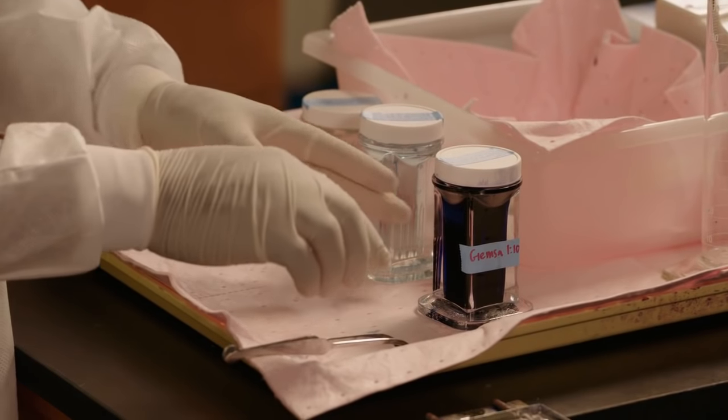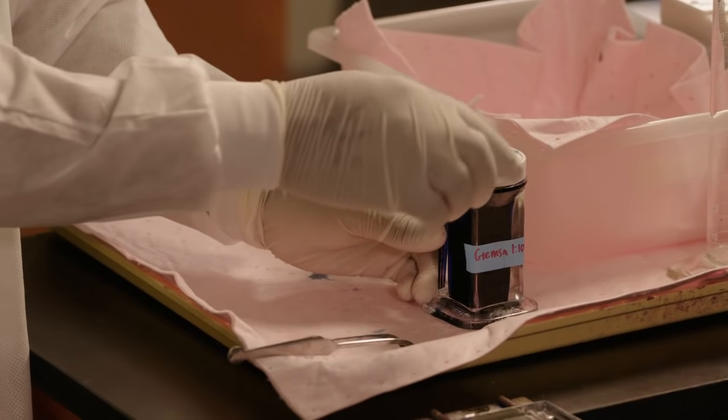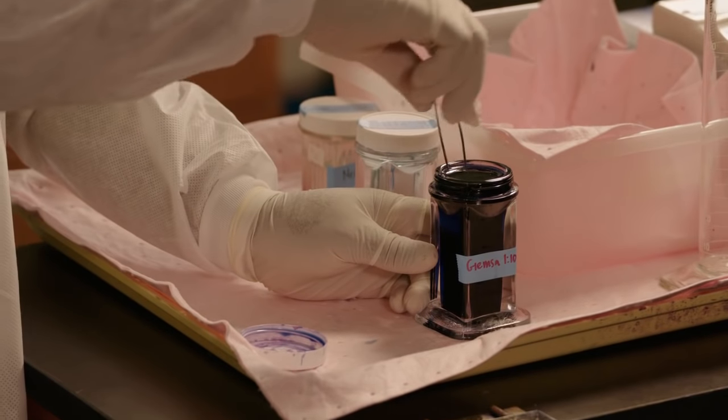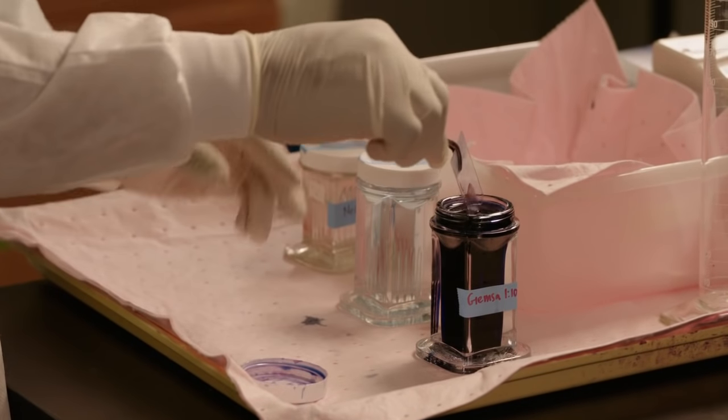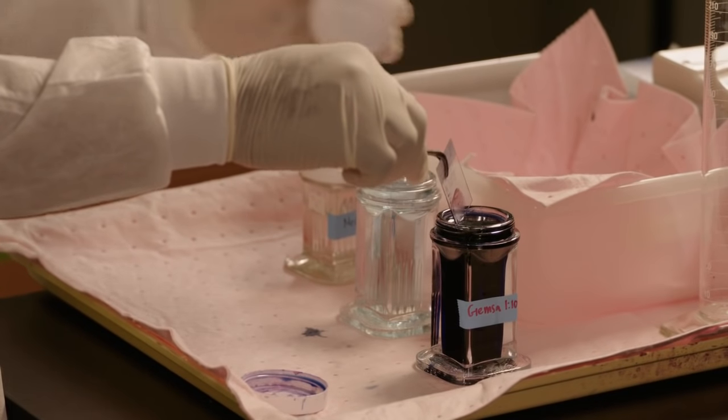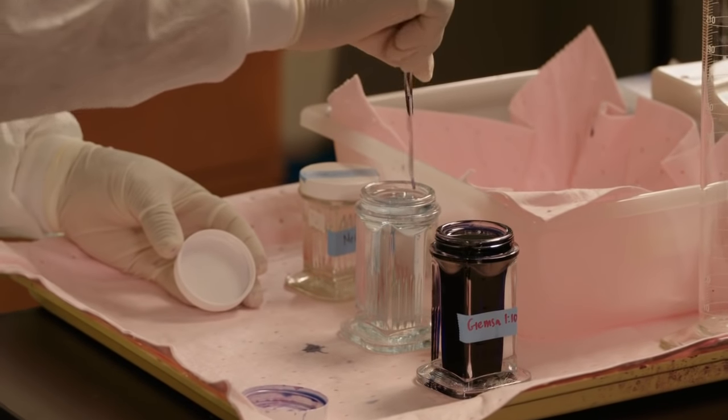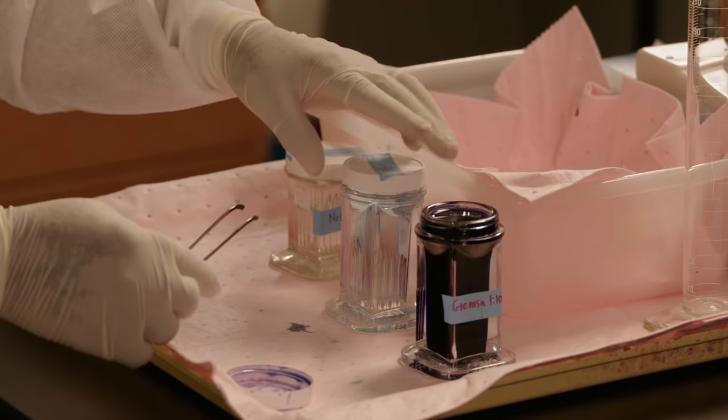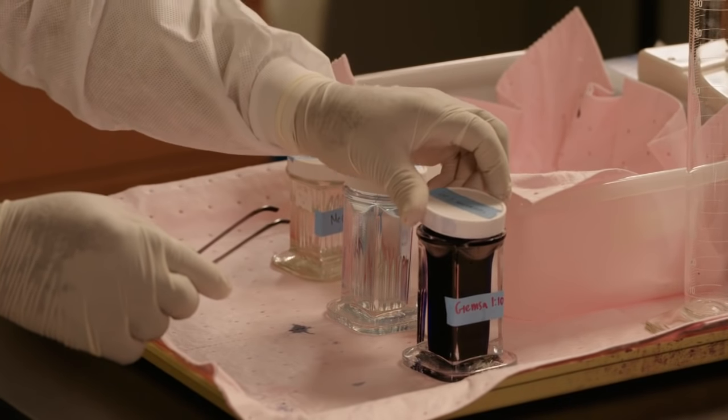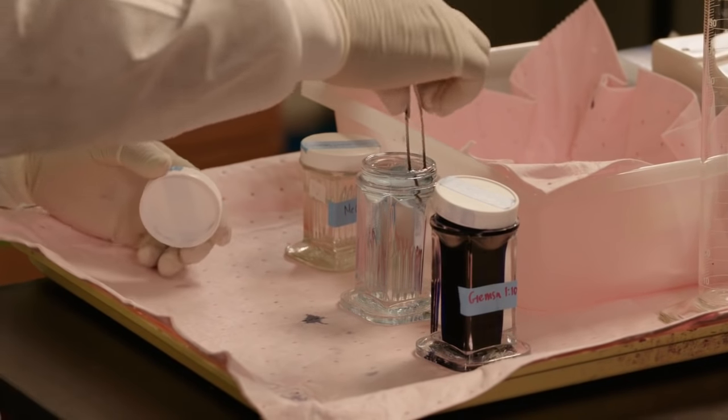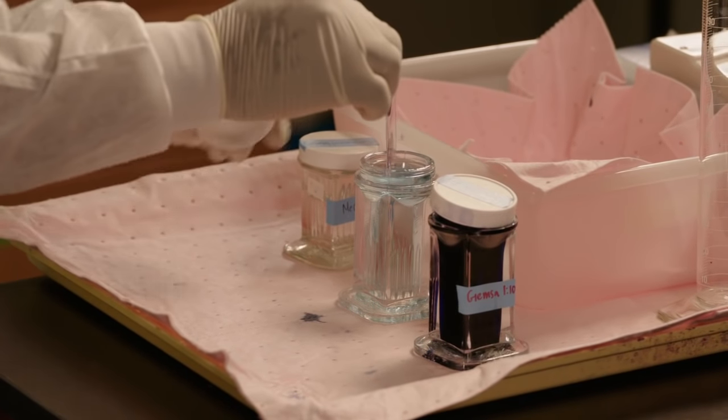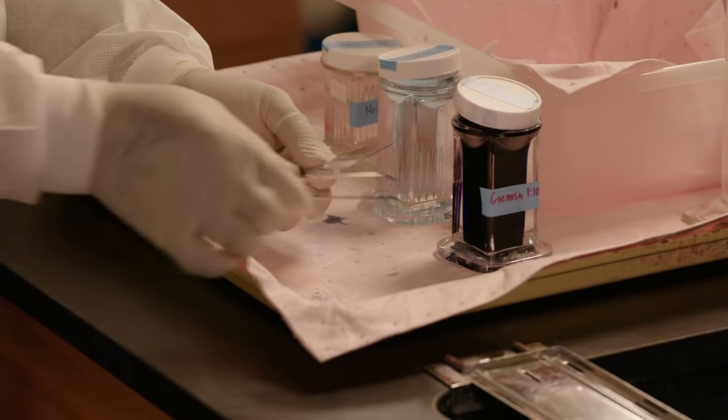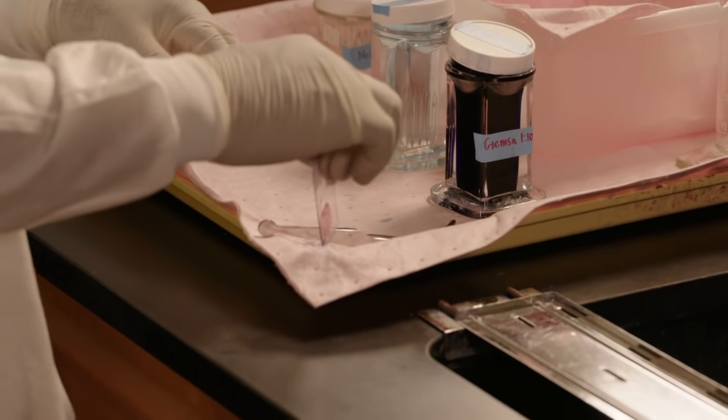At the end of the 20 minutes staining period in the working Giemsa stain, by means of a forceps, remove the stained slide and transfer it into a coupling jar containing water for rinsing the slide. Rinse it for 30 seconds. And then remove it from the rinsing water and then send it to the drying rack for it to air dry.